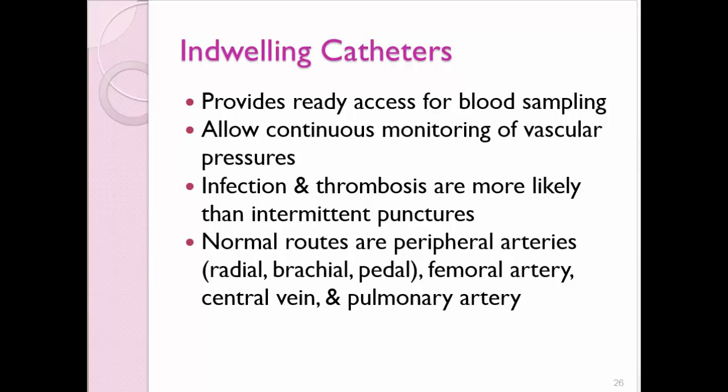Infection and thrombosis are more likely than intermittent punctures if you have that indwelling catheter. So you got to keep that thing clean, and you have a continuous infusion of heparin or saline solution, but not a lot, maybe 3 mLs an hour, but you have to keep it clean, so you got to make sure that's the case. So anytime we use these, we got to make sure that they're cleaned when we're finished.